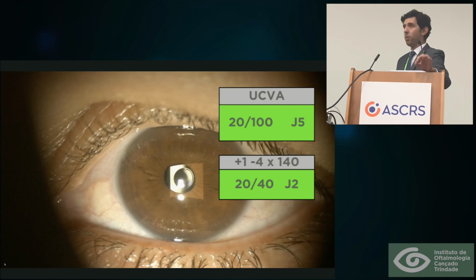So this is another important take-home message. The pinhole implant will work best when it's close to emmetropia. You don't want any sort of high magnitude refractive error because it'll need correction. And at the end, you can still provide her with glasses.